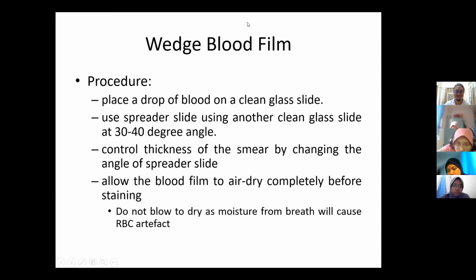Okay. And then use a spreader slide. Satu slide kita drop blood on, another slide we use as a spreader. It also must be clean. And then the angle must also be correct, about 30 to 40 degree angle. Of course, when you are doing it, there is no tools, no one will come and measure, oh, this is 35 degree, no, this is wrong.